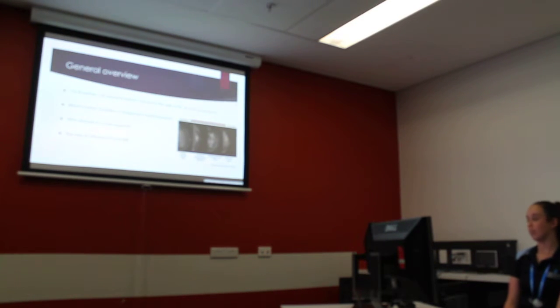Diagnostic mammography investigates the clinical symptoms, it monitors the patients with a history of breast cancer, and it may include other modalities such as ultrasound and MRI. It's also subsidised by Medicare Australia.